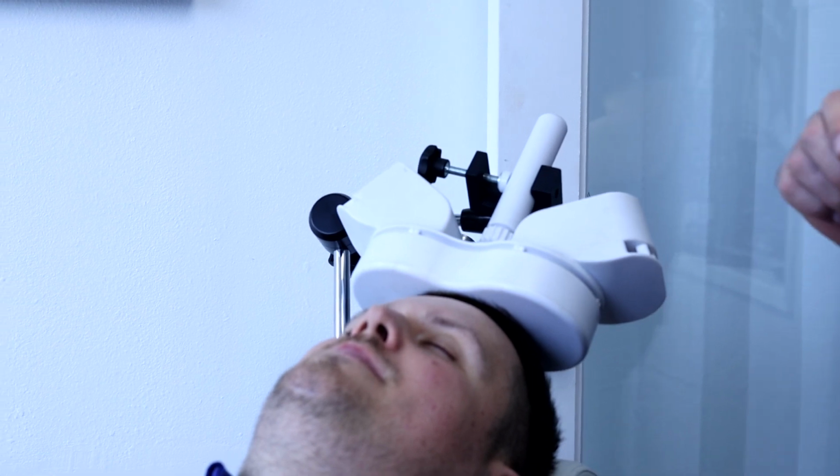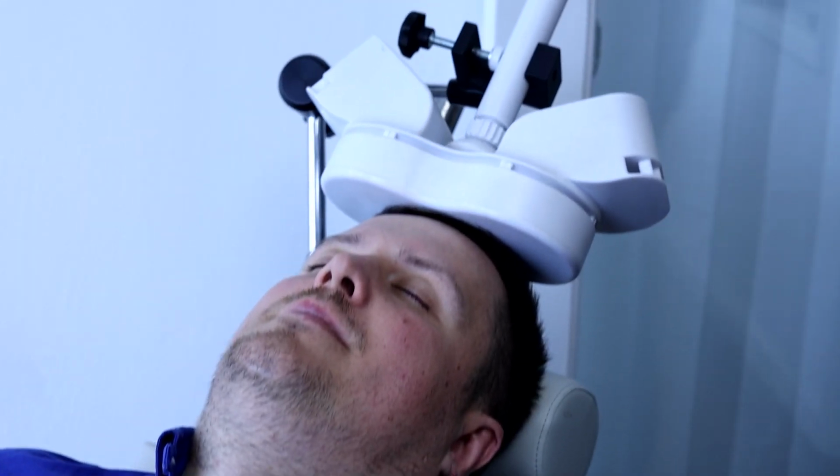So therefore, his own brain activity is directing the treatment. So that's pretty cool. So the treatment is being delivered once every minute. It's a 5-second train, 1 train per minute. And there are going to be 30 trains. While being treated, his eyes need to be closed. Yep. Voila, and that's it.